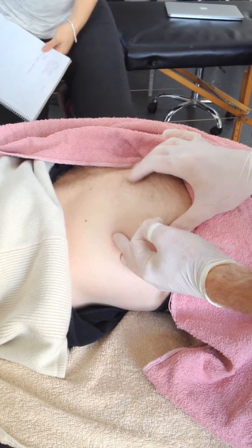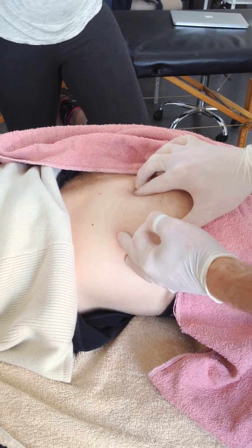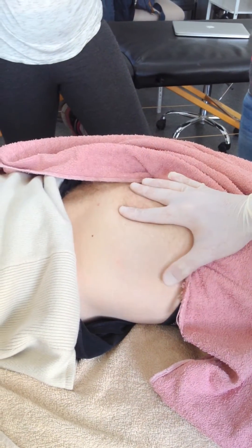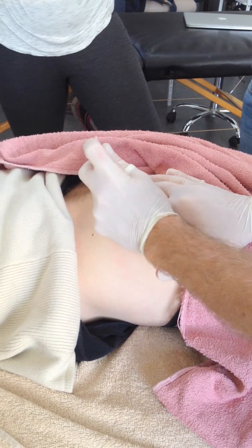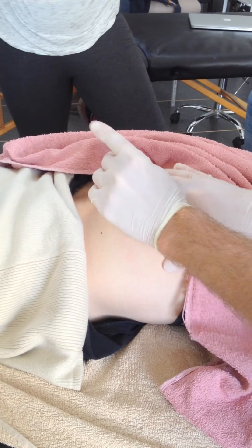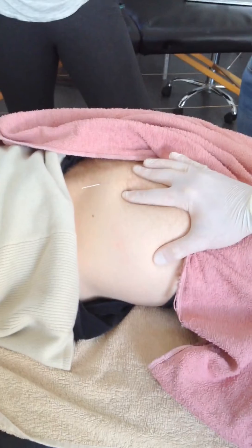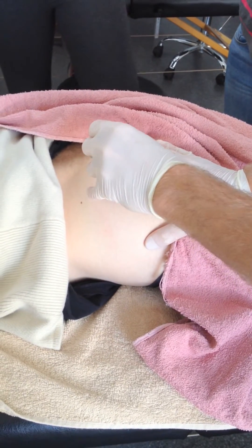Band up in here — needle straight into that. Normally you can get this with more or less deep or long needles. I'm still using a 75 though, just because I don't know whether we'd quite hit it with the 40 that I had out. So we're there and we're needling just straight in.